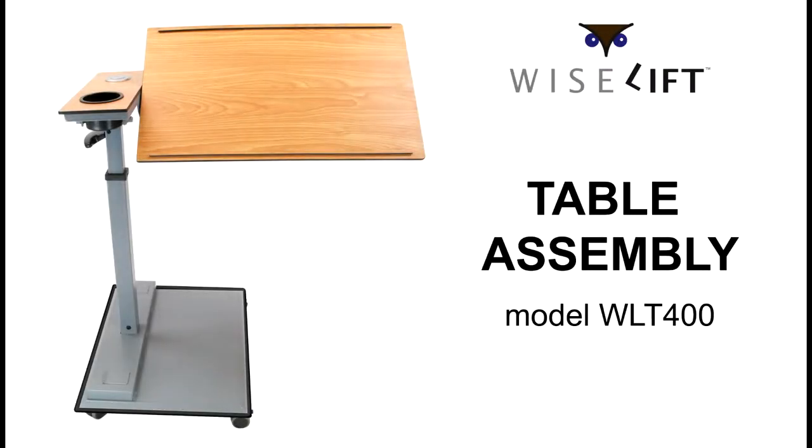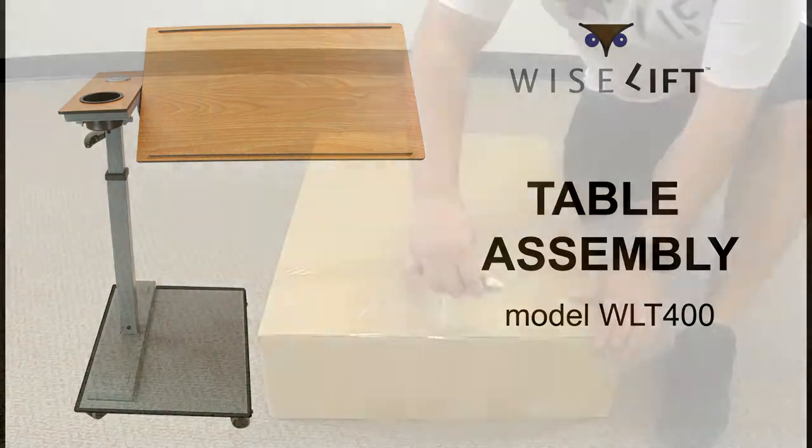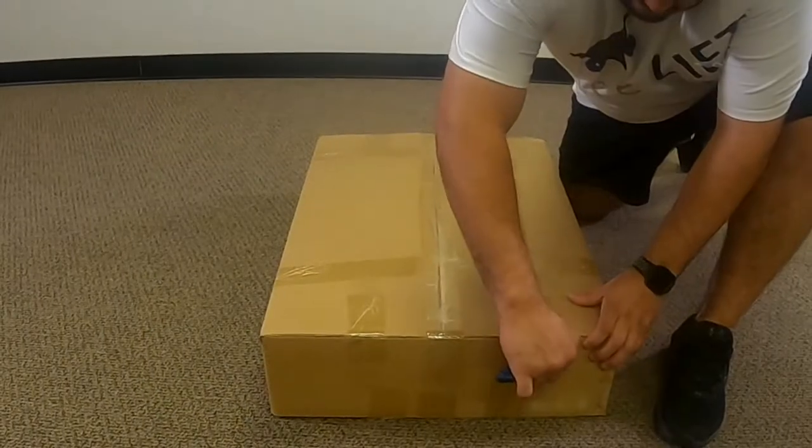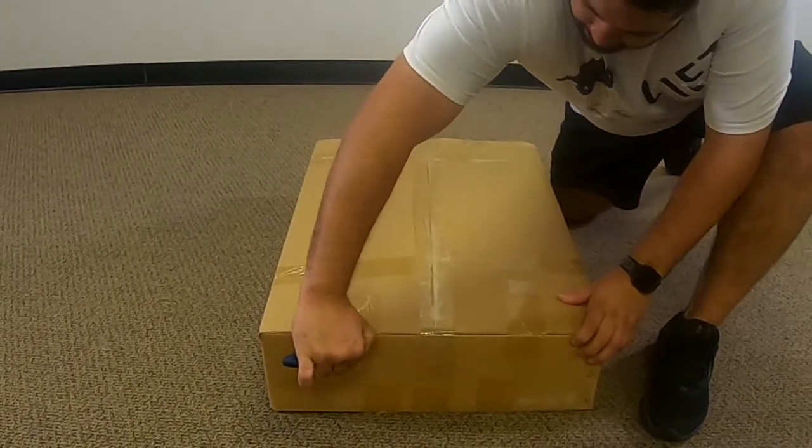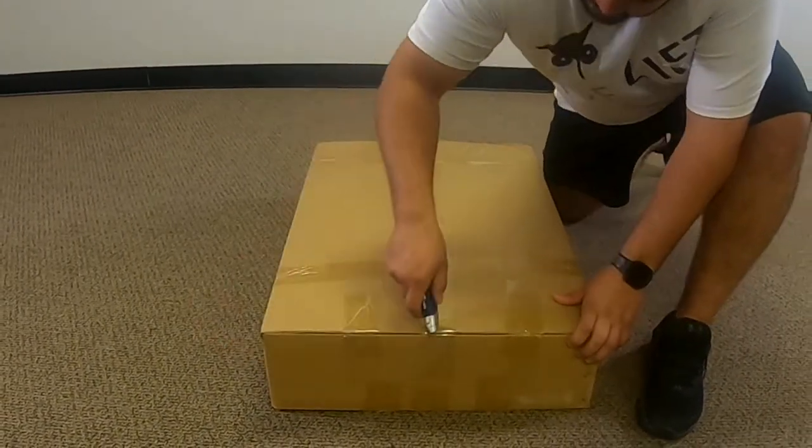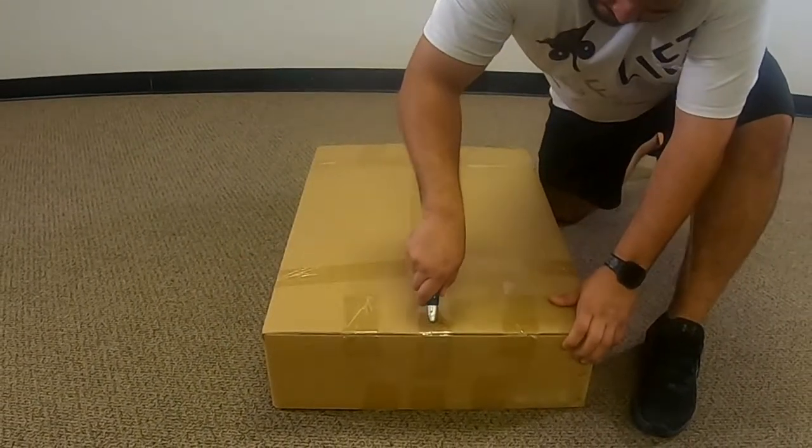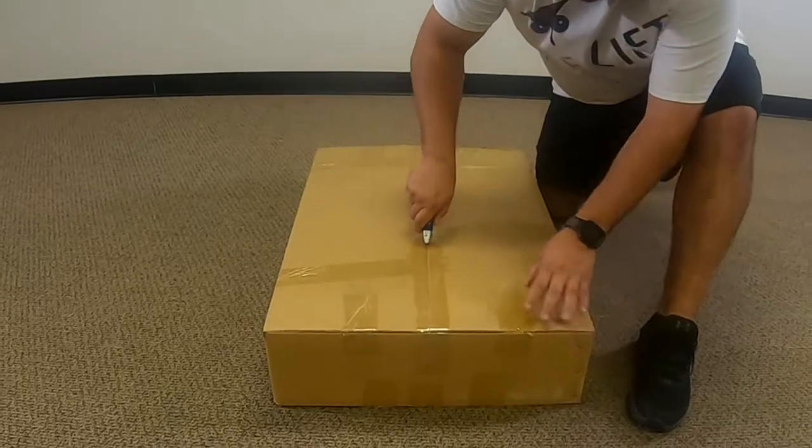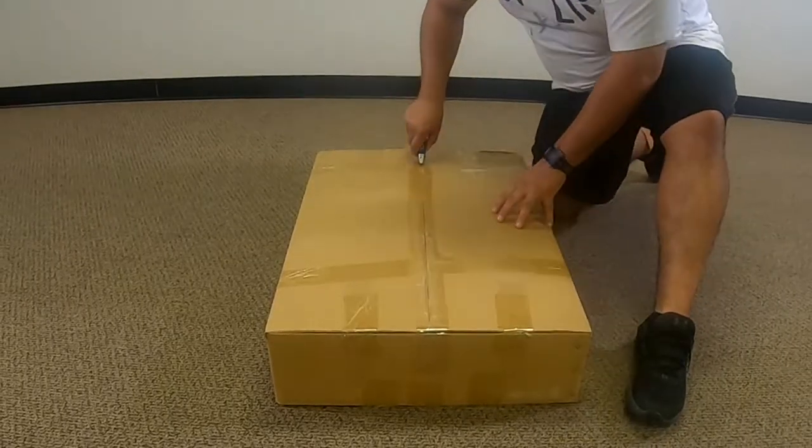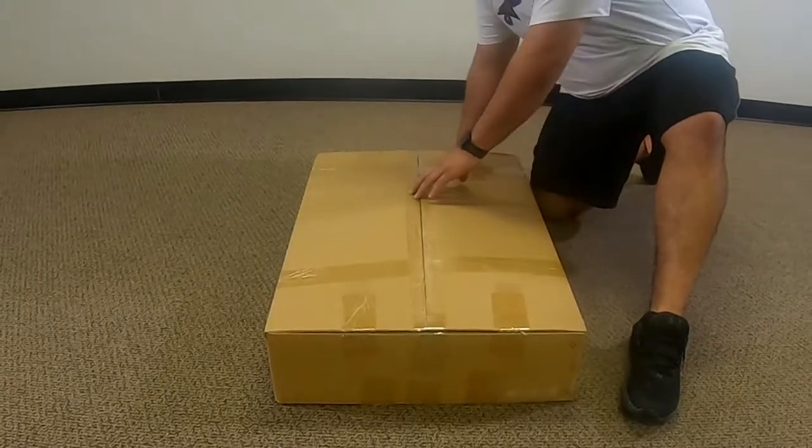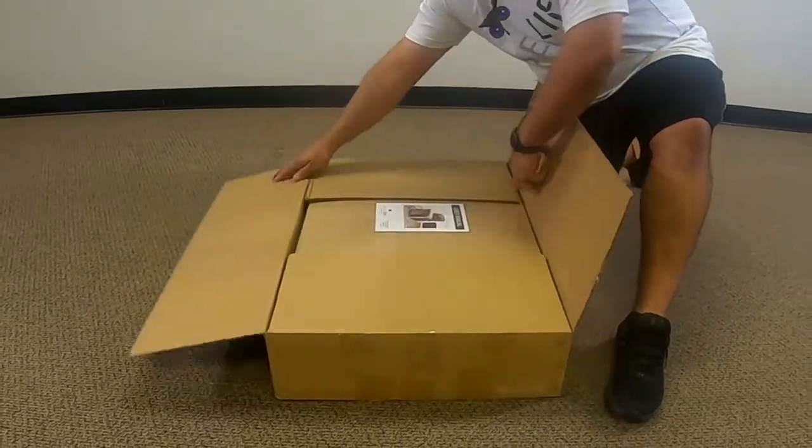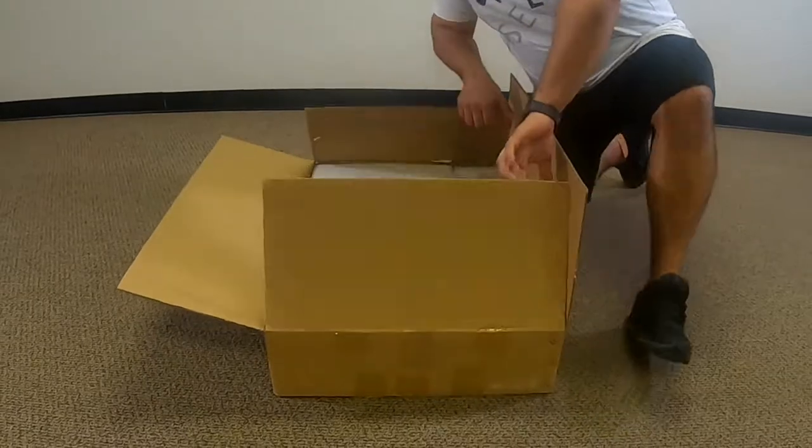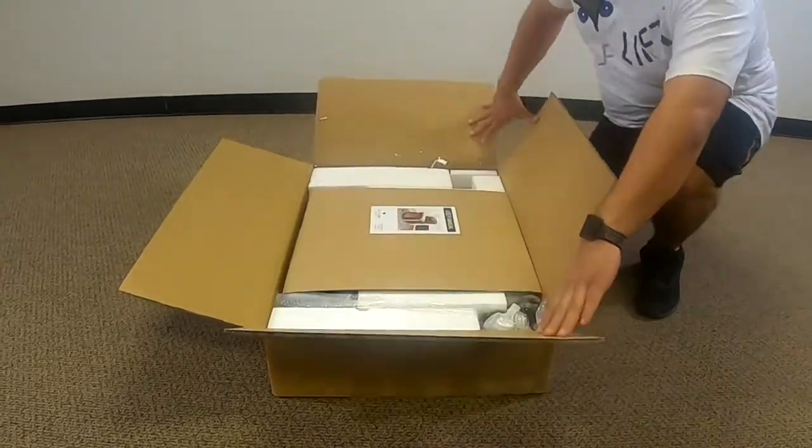Now that you have received your Wiselift table, it's time to assemble it. Use a short bladed knife to cut along the seams of the box. To avoid damaging the contents, do not use a long bladed knife. Once you have removed all of the components, check to make sure all items are included.